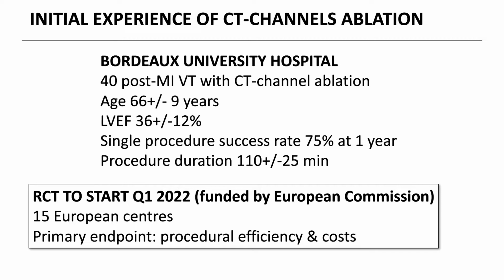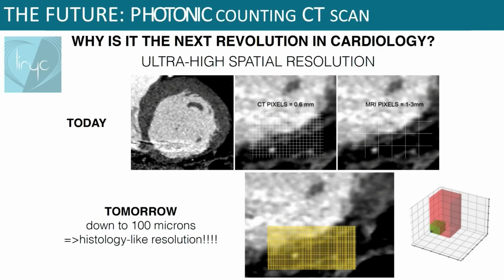We're about to start a randomized controlled trial where we would compare this approach to a more conventional one in 15 European centers. Now, what is going to happen in the future? Well, first thing is that we will have access to photon counting CT scanners.